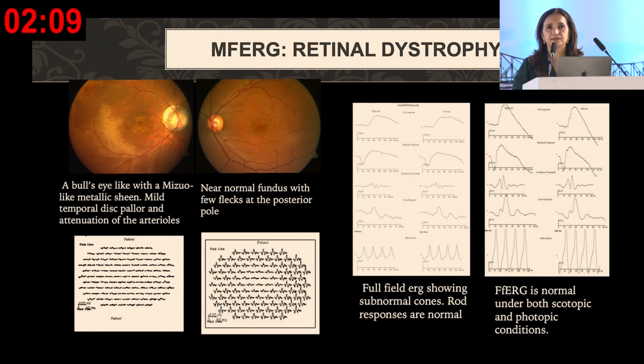With this, let us see how to interpret it. So this is, I don't know why people don't find electrophysiology interesting, but I don't know. I find it very interesting. So if you see mathematically, if you see the right-hand side picture, and the left one, almost clinically, if you see, they look similar. But if you do an electrophysiology, a full field, almost similar. The right one slightly delayed.